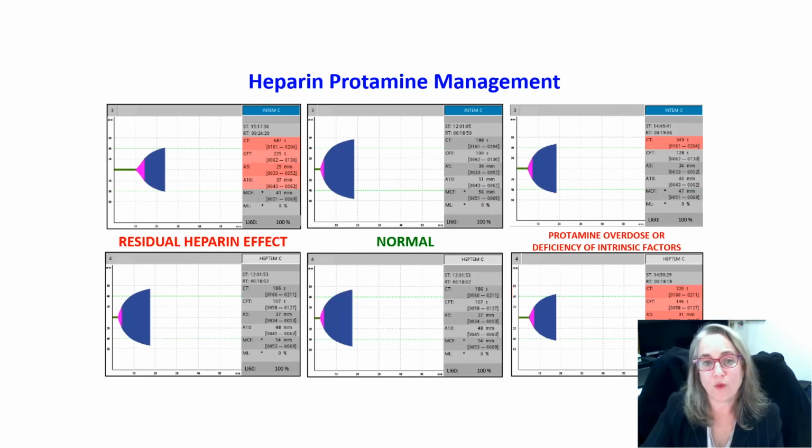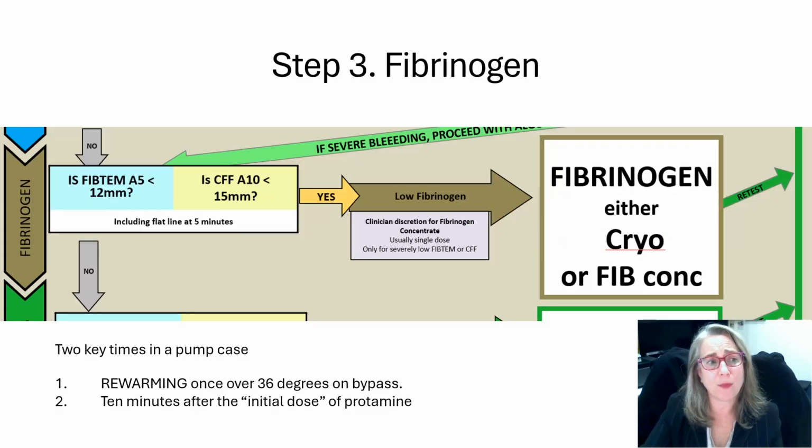Similarly, if we've given a factor V inhibitor or lots of protamine, you might see a prolongation of both of those. And so both clotting times are prolonged in this, and we would either wait or we would be thinking about whether this patient has an intrinsic factor problem.